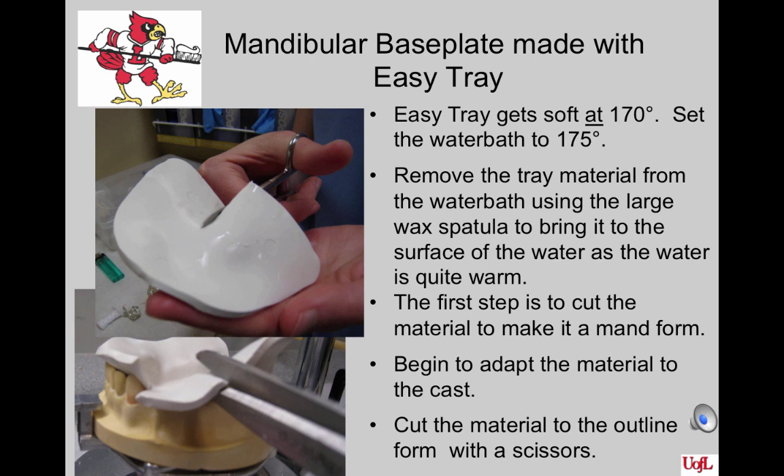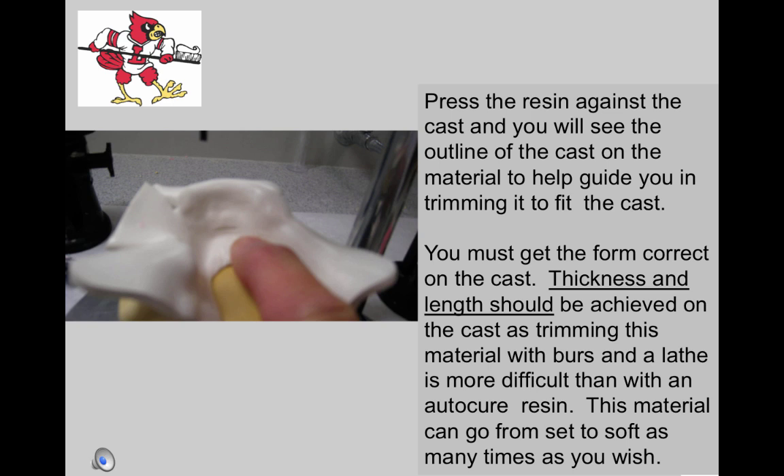Begin to adapt the material to the cast — push it down on the lingual of the anteriors first, then spread it widely to cover the posterior areas over the ridges and adapt it to the cast. The material will get stiff rather rapidly, so you must work quickly. If the material gets too stiff, remove it from the cast, don't straighten it out, place it in the water bath for a few seconds, remove it, and continue. When you get the form adapted, remove it from the cast. Press the resin against the cast and you will see the outline of the cast on the material to help guide trimming with scissors. Thickness and length should be achieved on the cast, as trimming this material with burrs and a lathe is more difficult than auto-cure resin or Triad. This material can go from soft to set as many times as you wish — there is a learning curve, but once you get used to it, you may like it.